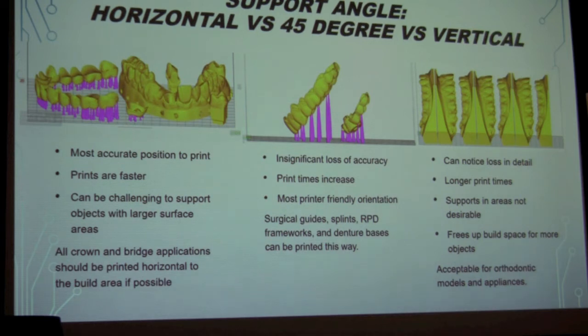The reason why is because that's when the highest precision, the XY precision, is actually going to be projected onto that build head. These are going to actually print faster as well, because as we all know with 3D printers, the taller the object is, the longer it's going to take to print. But it can have some drawbacks.